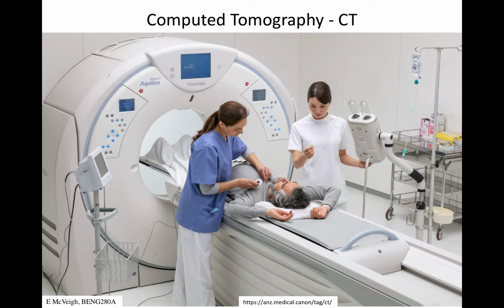So we're going to look at the hardware and just the methodology of collecting data to create computed tomography images. This is from the first lecture, where this is a standard CT scanner here. It's basically a cylinder, and the patient is on a table.